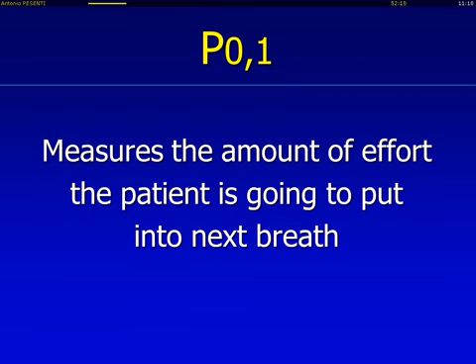I think one of the simplest measurements is P0.1. Most ventilators provide a measurement of P0.1. P0.1 is a strange name. It measures the amount of effort the patient is going to put into the next breath. It exploits the fact that our brain drives the muscles.